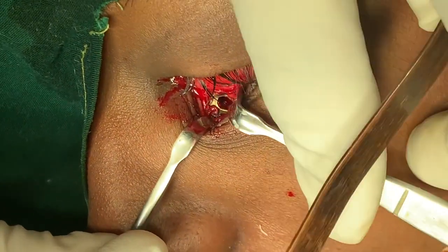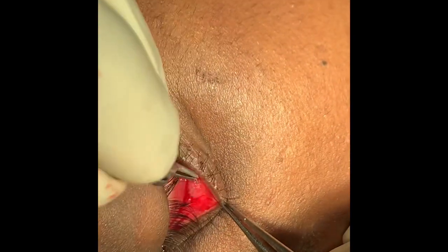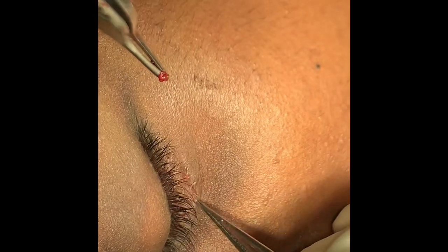Okay, now we just have to suture. I'm going to suture this in two or three layers. Okay, thank you. So just done the suturing now. I don't put many sutures, we just put two there, 6-0, and then leave the rest open. That's it.